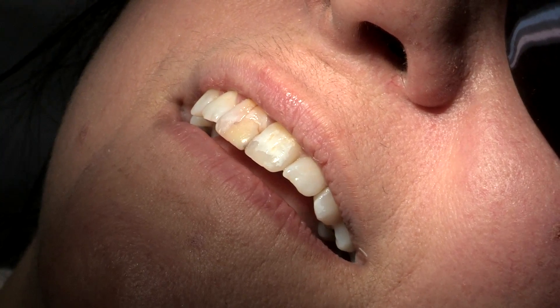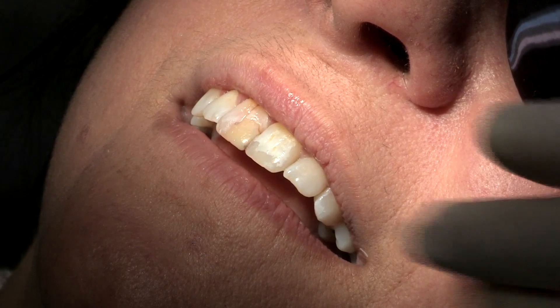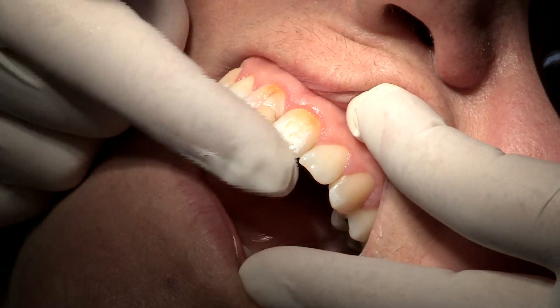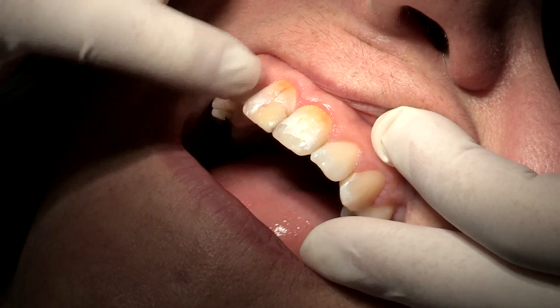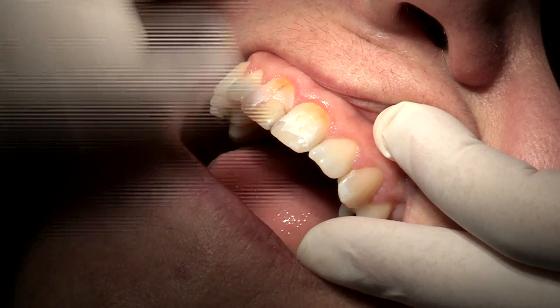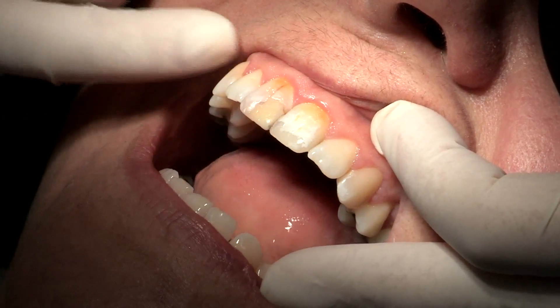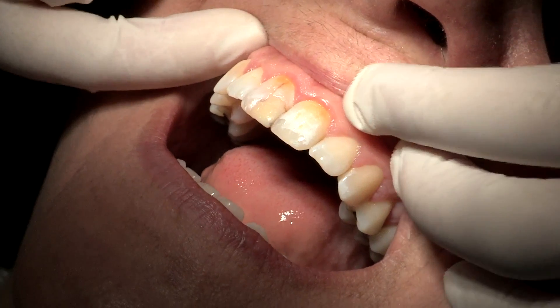Hi, my name is Sigal and today I will demonstrate the UVeneer system, how it works with all the steps. This is a case of two central incisors with staining, old composite, and fluorosis. As you can see, her teeth are quite good — the shape is nice — but we will need to mask that, and that's what we're going to do today.